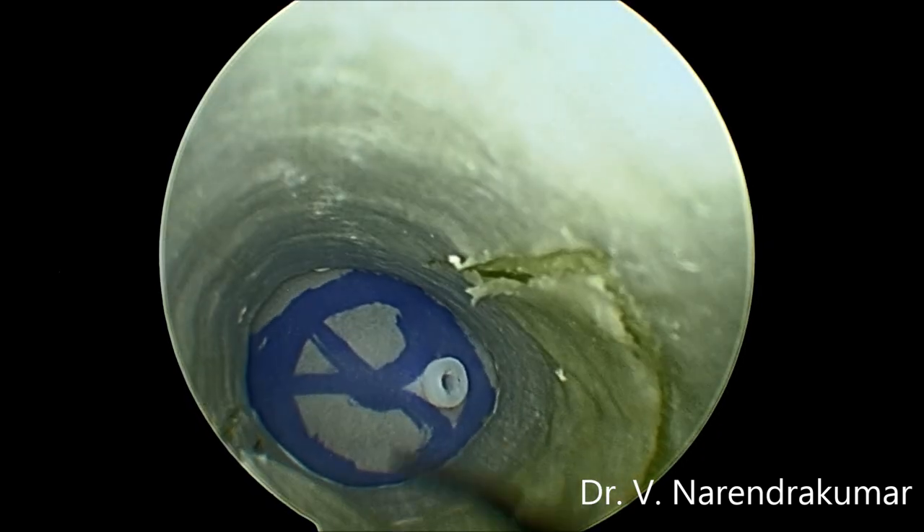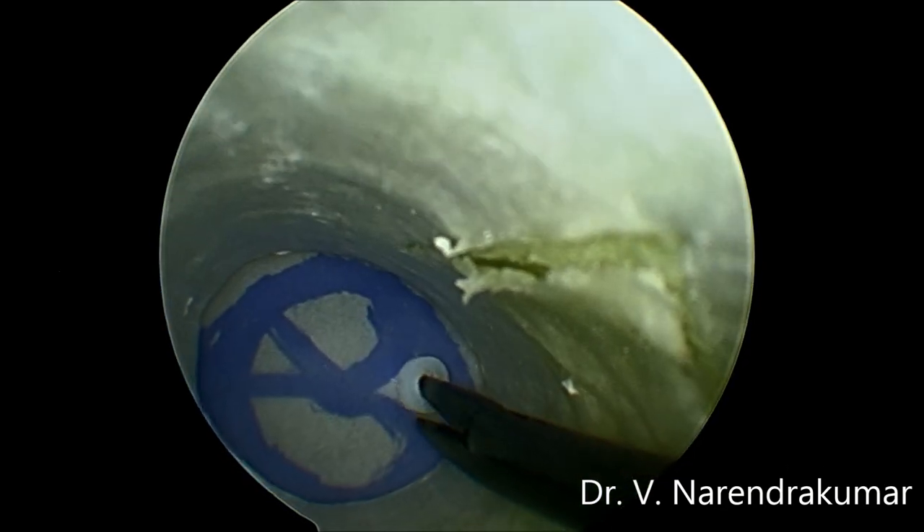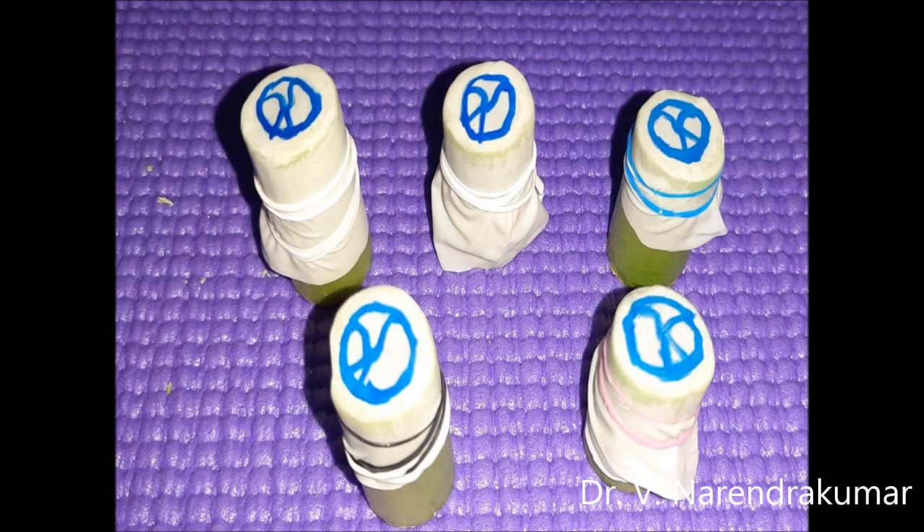Apart from this, the third training exercise is: you can remove and experience the feel of the grommet that we have inserted. You can use multiple pieces for your training.